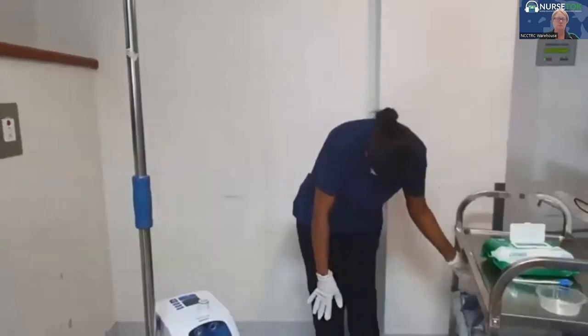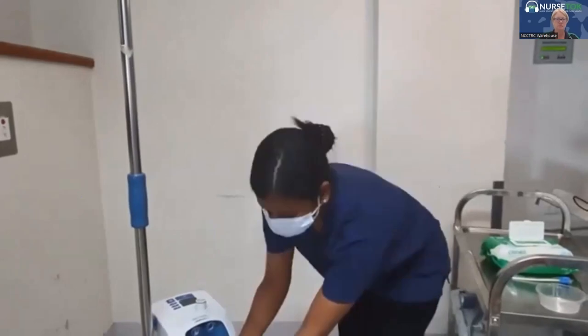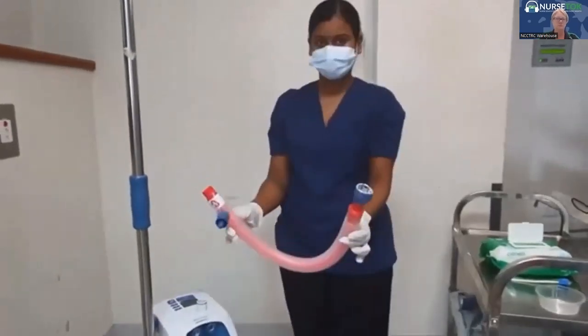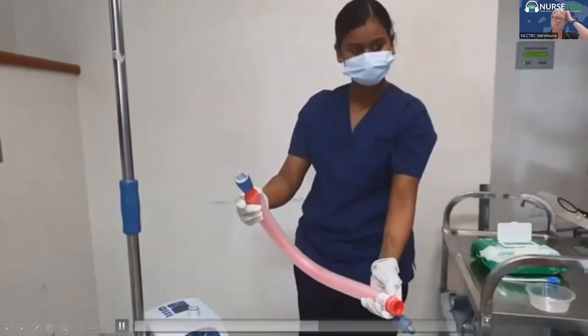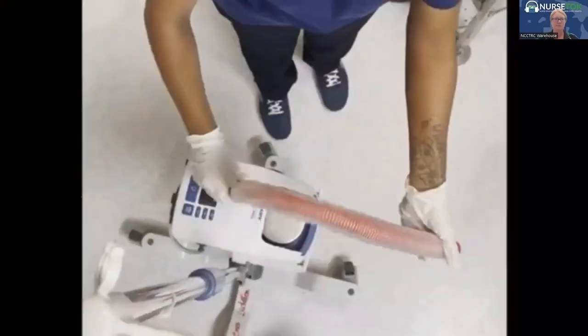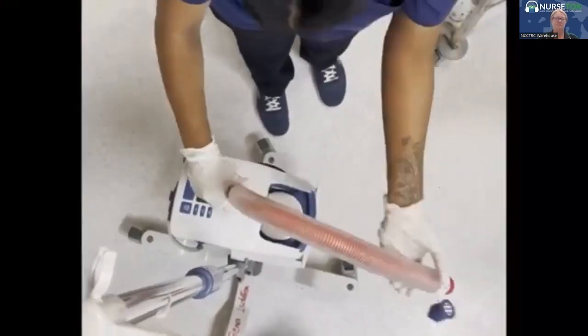Once all your cleanings are done, now we are going to disinfect the EVO machine. Using the red disinfection, which is red in color, we'll disinfect the machine immediately after cleaning. So we insert the blue end of the tube onto the top port, push down to lock.